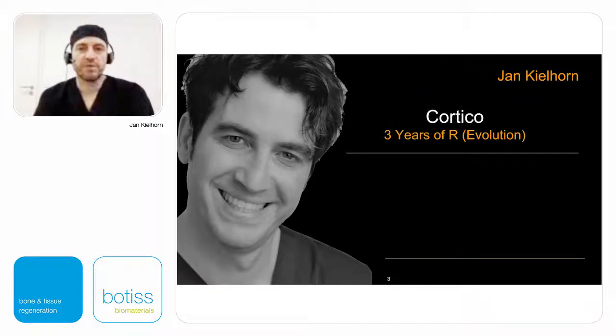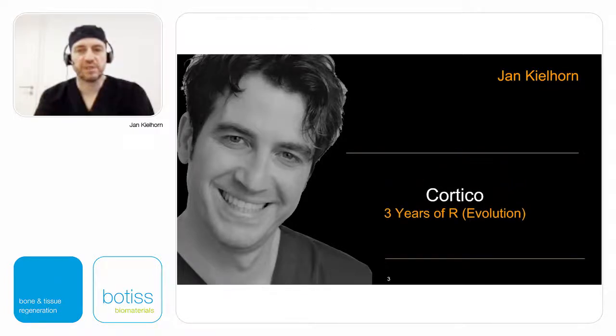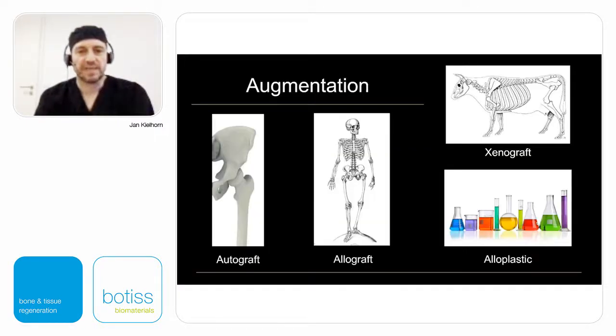We are now overlooking 3 years of revolution, as we call it, or evolution. This technique is actually based on the classical bone blade technique by Professor Khoury. The problem was that, of course, the Khoury technique had a severe surgery. You didn't have the material handy whenever you needed it, and you couldn't use it in all those indications. And so we changed a little bit about it. So it's actually an evolution of the Khoury technique.